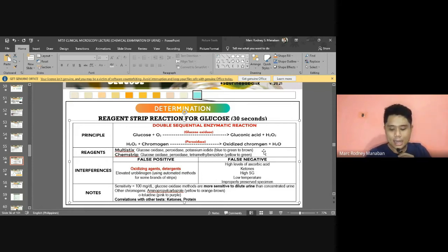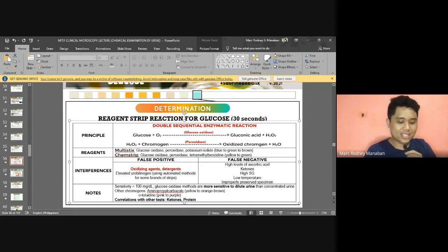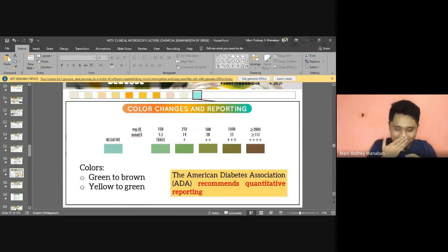All right, okay. Now, in cases lang na, you maybe think, in cases lang, example, infant, no, ang patient, tapos negative imuhang strip, so, and you're detecting galactose, you can perform, of course, confirmatory or other classic chemical tests. Ay, sorry, wala pa pala. Sorry. Sorry, sabaw na. All right.